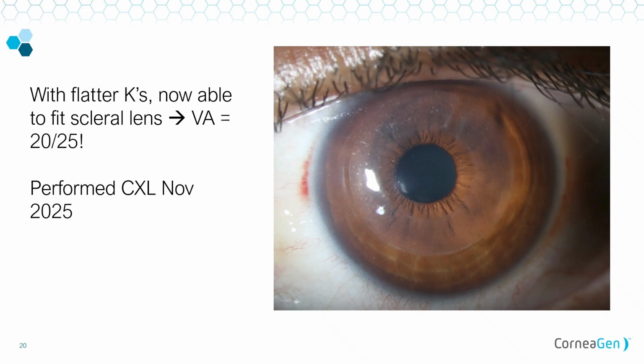You really want to set expectations. This is a great surgery, super powerful. It is not a cure-all, right? There's still a role for cross-linking. There's still a role for secondary procedures: ICL, toric IOLs, topo-guided PRK, RGPs. There's a role for all that, but this is just something I've been really, really excited about having on offer to the patients.